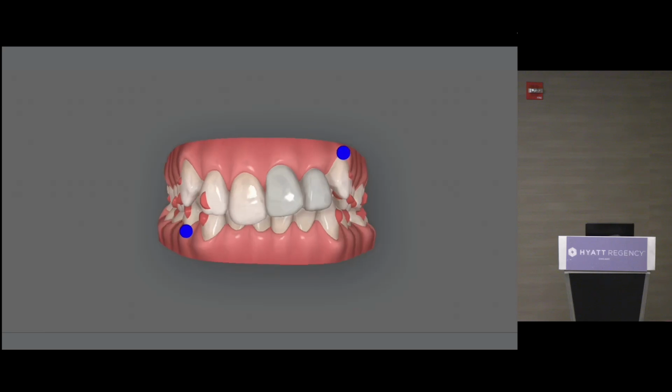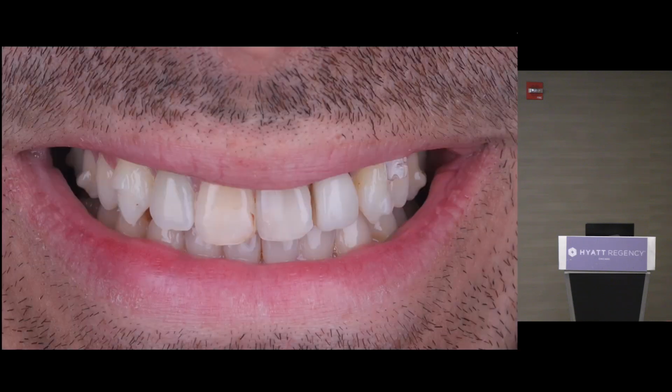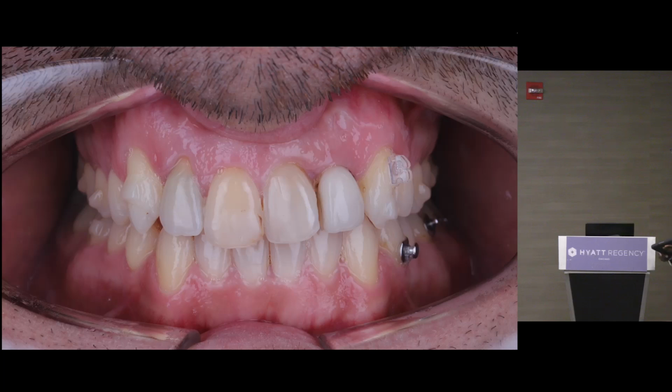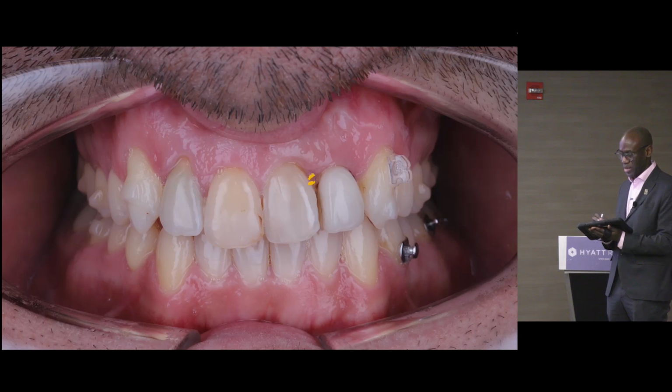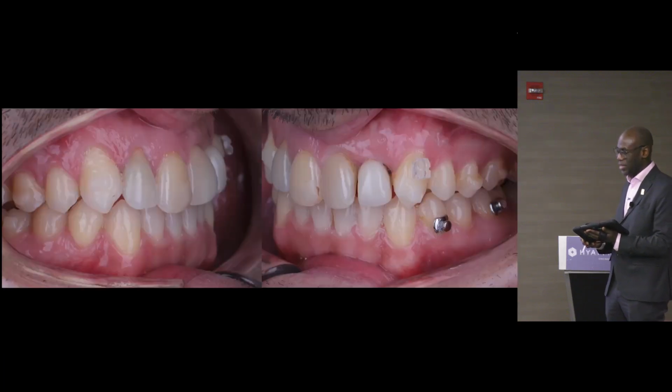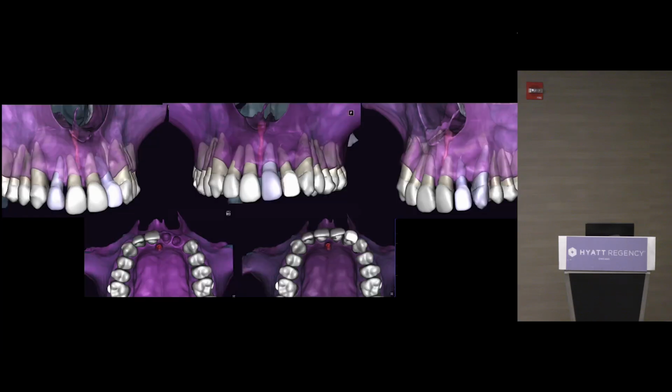And from straightening the teeth, the patient has gone through a number of orthodontic appointments, shall we say, to get to the point where they're ready to see me. Now, the aim here is to replace the upper left 1 and 2. You'll see here we've got slightly less papilla at the beginning. It's slightly blunted, probably a little bit inflamed in that area. And this is the point where they come to see me to replace the upper left 1 and 2.